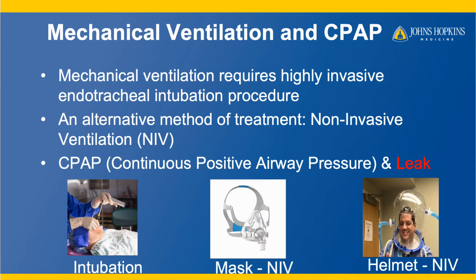However, the CPAP mask itself is prone to be quite leaky under air pressure directed from the CPAP machine, and leaky viral particles from the patient's respiratory tract may be released in the vicinity of the patients, and may cause some high risk for infection for clinicians or other visitors. This is the main reason why CPAP has been deterred so much from being used in COVID-19 therapy. So, if we could solve this leakage problem, then there is a significant opportunity to adopt NIV CPAP as part of the routine COVID-19 therapy.